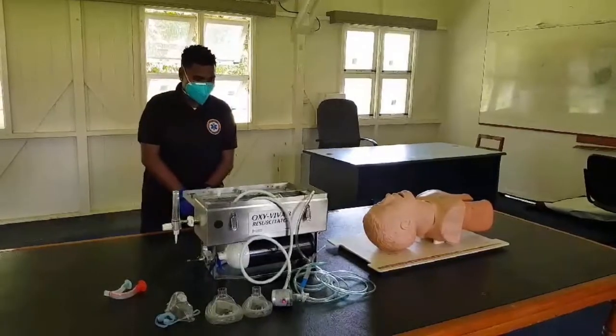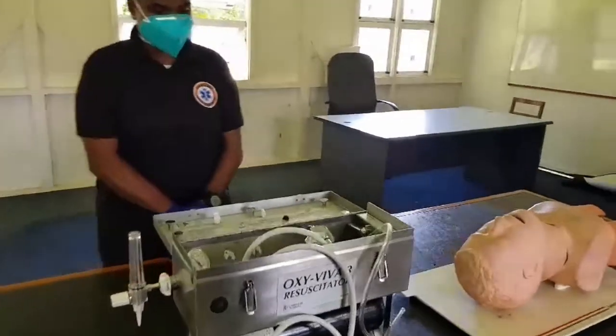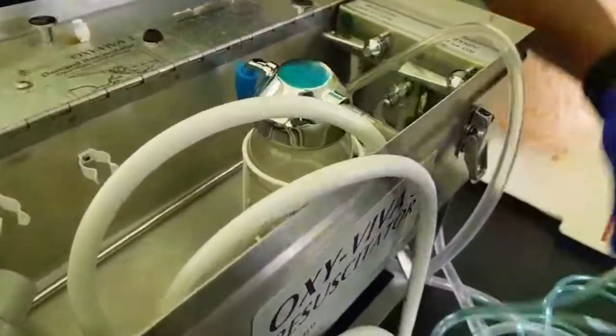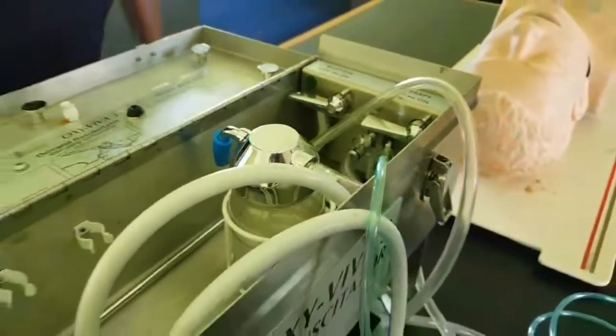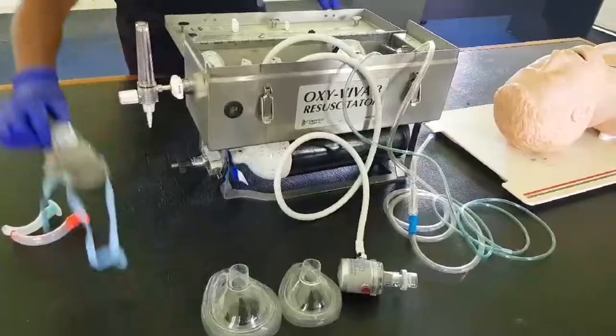Step number one: connect one end of the therapy tubing to the therapy outlet under the on/off lever. Step number two: connect the other end of the therapy tubing to the therapy mask.